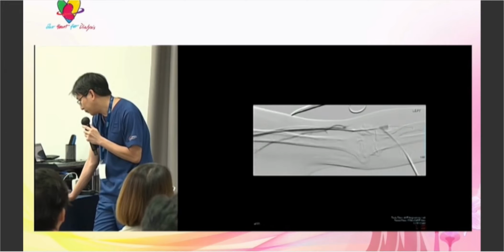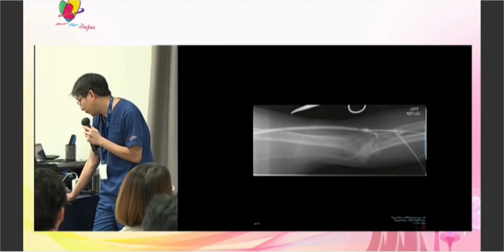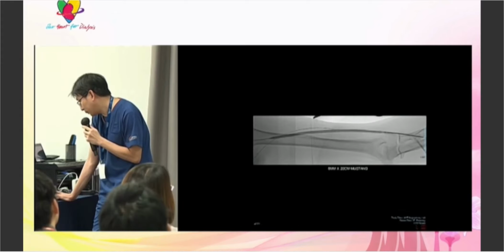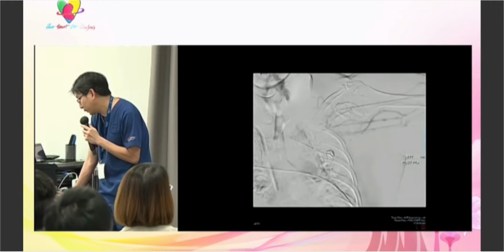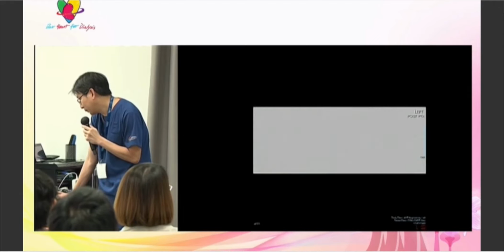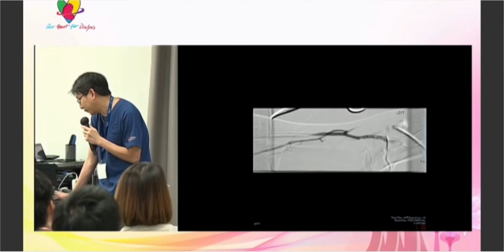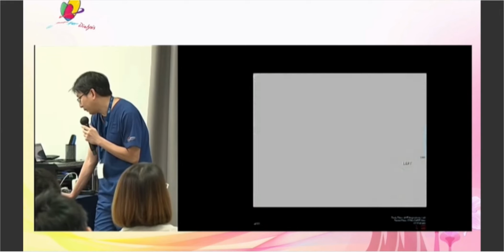I think I came back and I tried to mature it a bit more with a longer balloon. That was me accidentally pulling the sheath out, but it was all right. So I tried to mature the whole cephalic outflow up with a 6. So it looks prettier now. It looks bigger, but again, learning lessons. I think I hit it a lot of times because it tended to spasm, that's right. And that's one of the learning lessons.